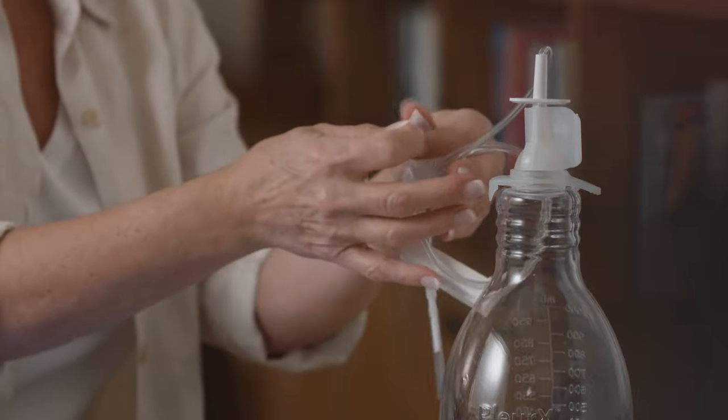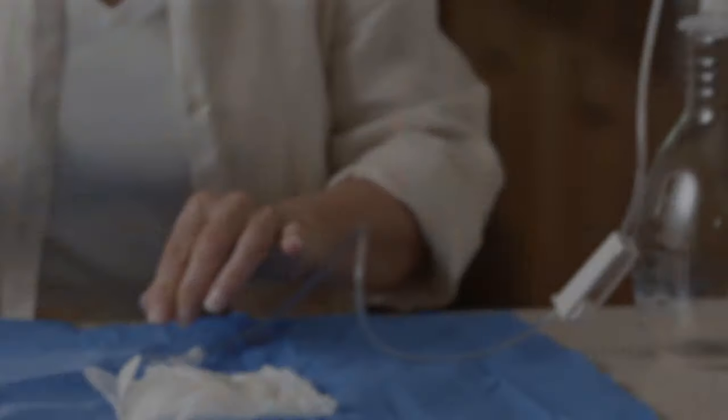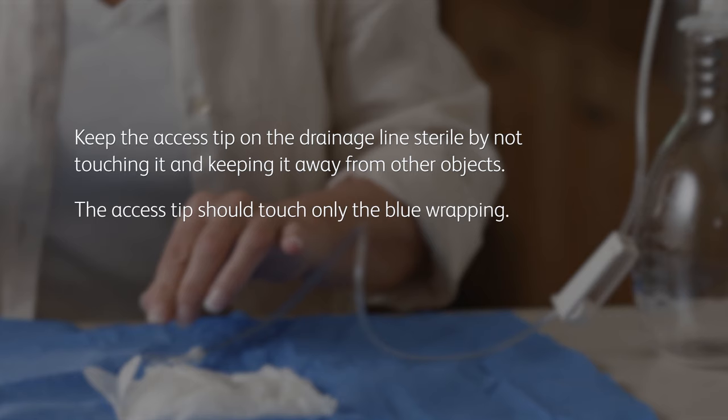Remove the tape from the drainage line and set the covered access tip on the blue wrap near the other items. Make sure you keep the access tip on the drainage line sterile by not touching it and keeping it away from other objects. The access tip should touch only the blue wrapping.